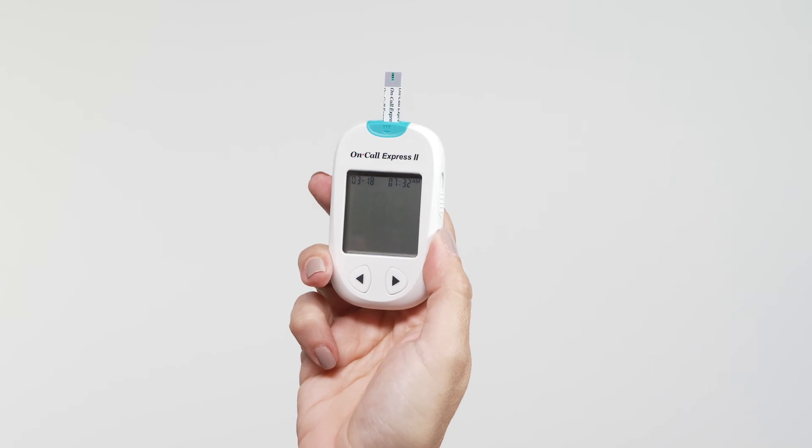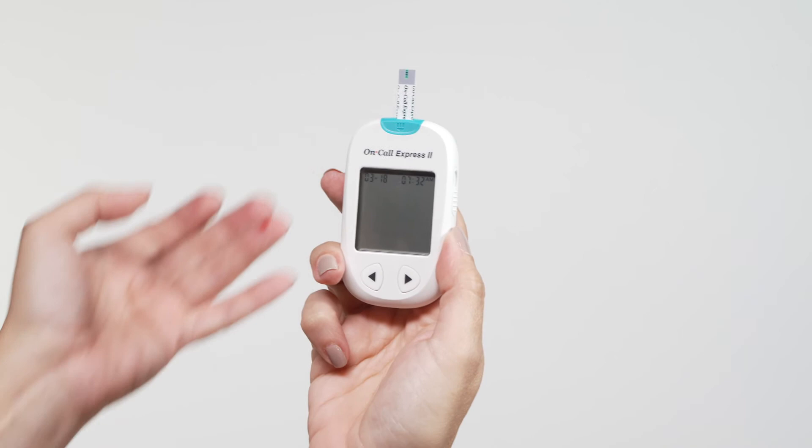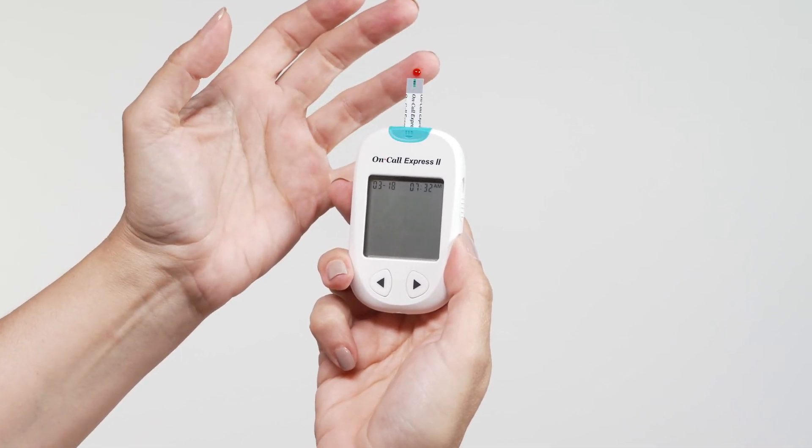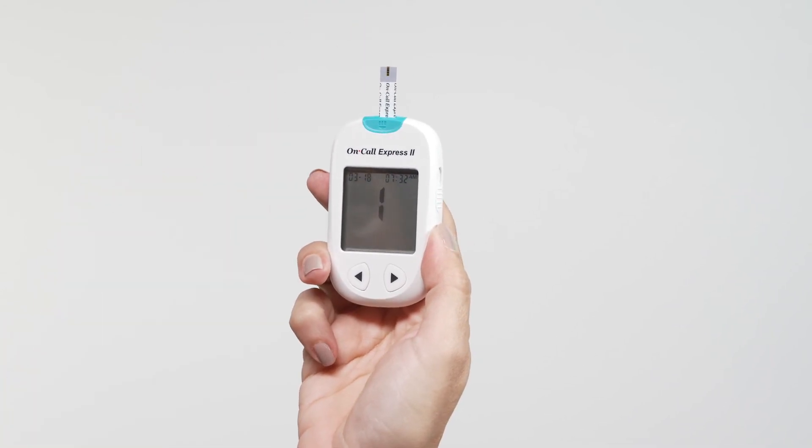Touch the blood sample to the sample tip at the end of the test strip. If the audio option is turned on, the meter will beep to indicate the sample is sufficient and the measurement has started. The meter will count down from 3 to 1 and then display the measurement result.